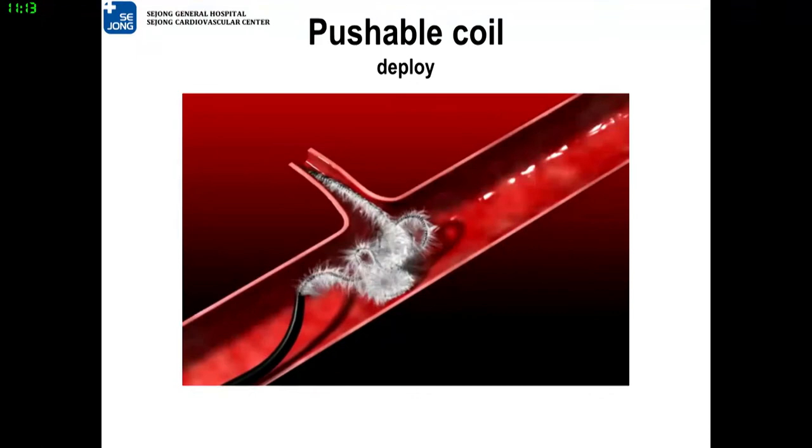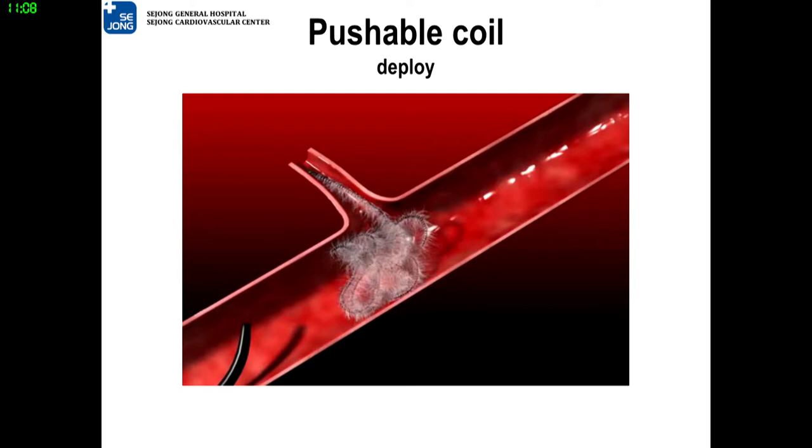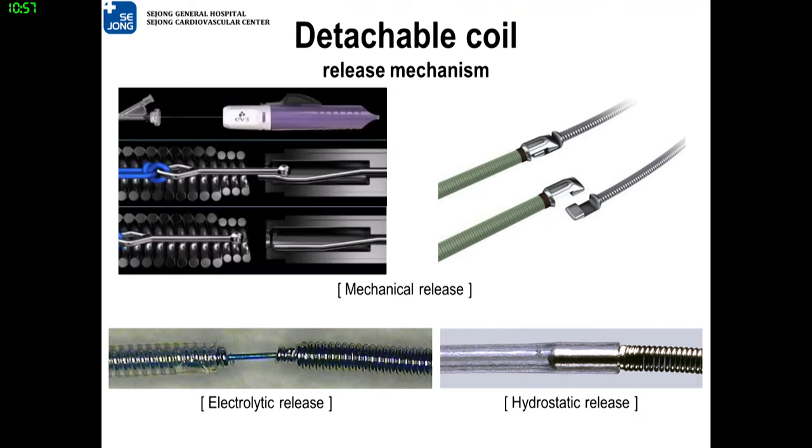This is the virtual demonstration of pushable coil deployment. The vascular coil is loaded, delivered, and nested to the desired site. Detachable coils have various release mechanisms, such as mechanical, electrolytic, or hydrostatic. Recapture and reposition is available till satisfied.